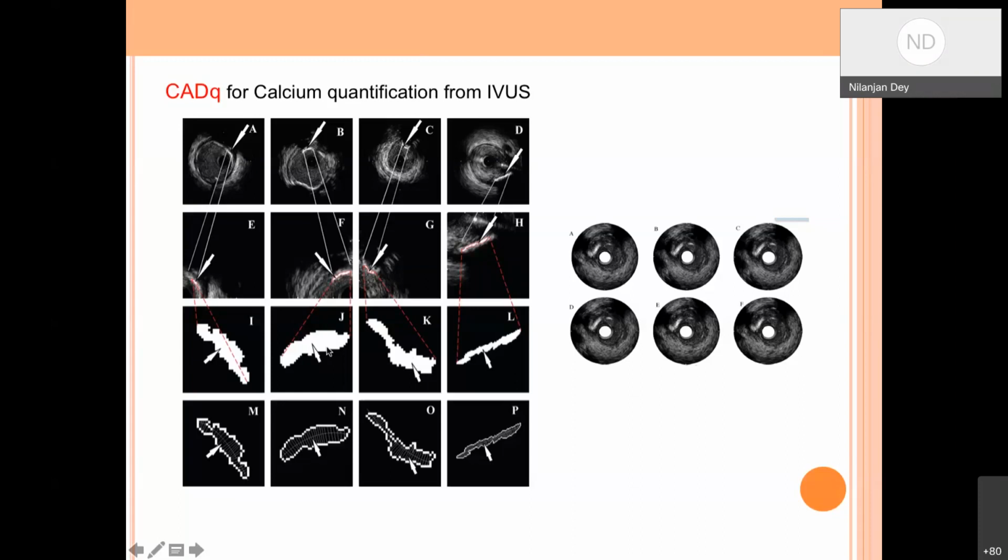Last but not least, it's always good to get good accuracy, but always be cautious about false positives. If a patient doesn't have the disease but is tested as positive, that is problematic. So we always have to look into specificity and sensitivity. The CAD system needs to be designed in such a way that it can correctly identify those patients without the disease. If you don't have the disease, the CAD should tell you that you don't have the disease.